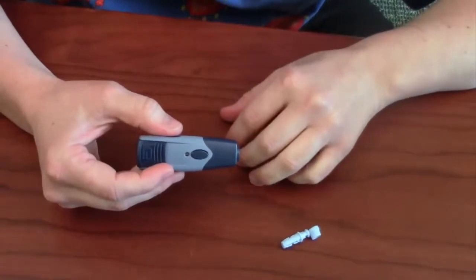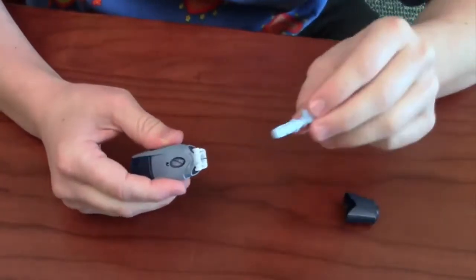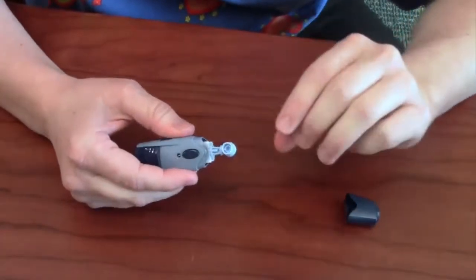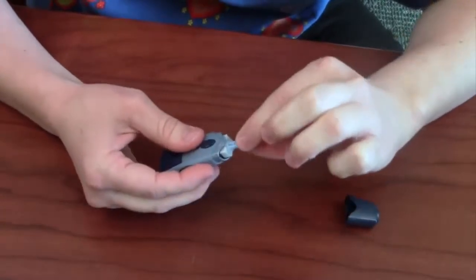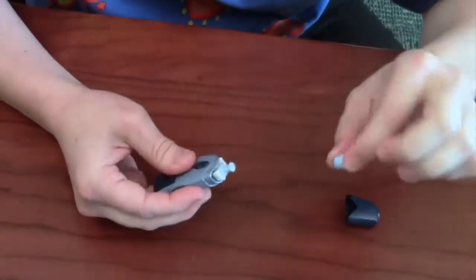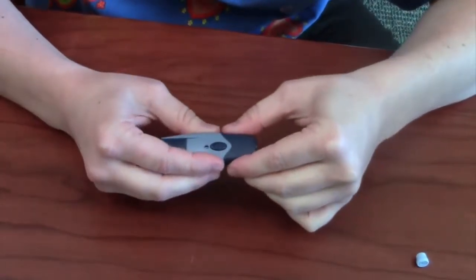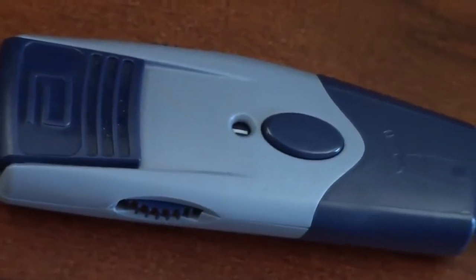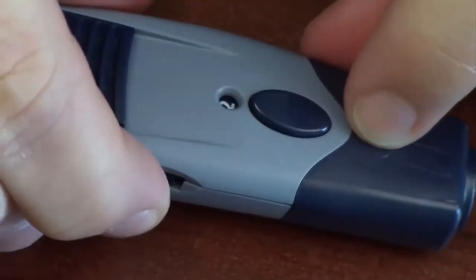To prepare the lancing device for use, the first thing you'll do is remove the cap, insert a lancet, and hear it click. Then remove the top piece by twisting it — that exposes the needle. Replace the cap. The next thing is to set the depth of the needle.